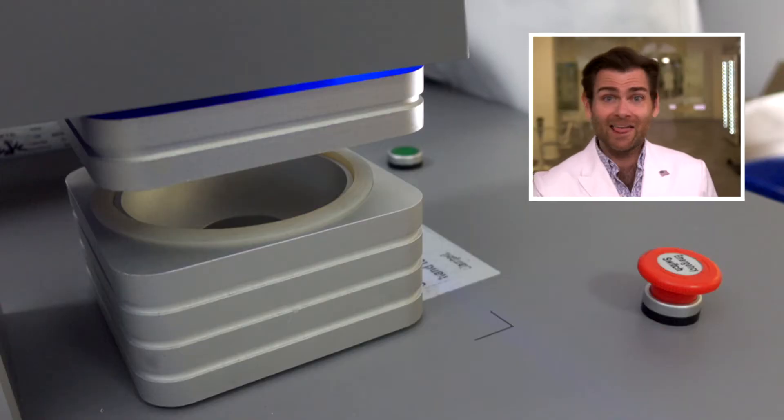Hey everyone, welcome back where we are testing every single mask in the free world. That's right, all the masks that you can get in America right here in our PFE machine. We're testing it for you. Today we are testing the Mediacom Safe Mask Free Flow. This is a really cool mask but before I show you why, let's get it inside the clamp machine.